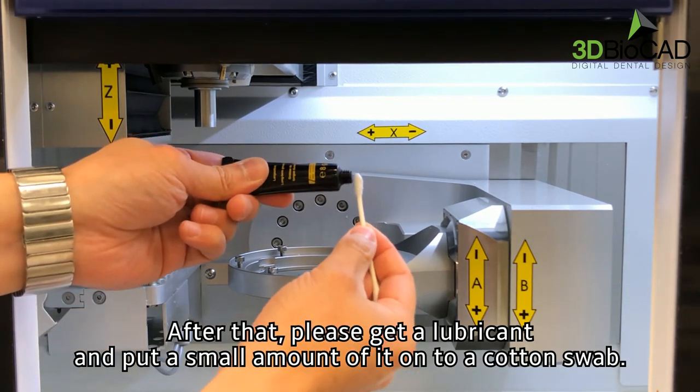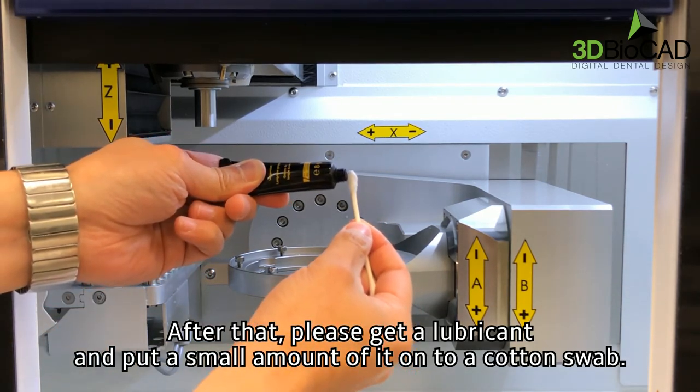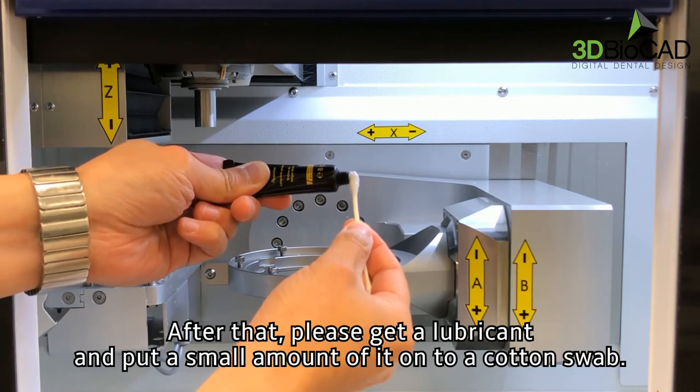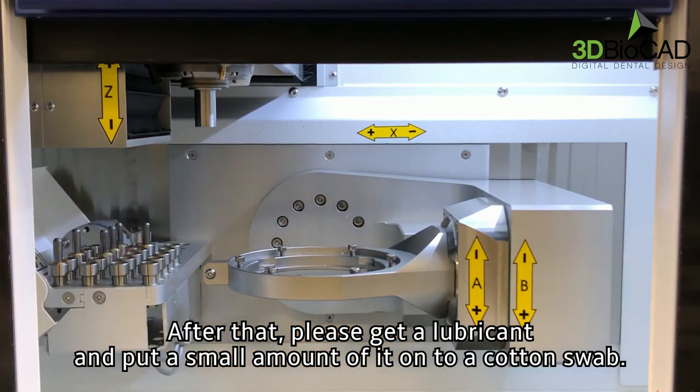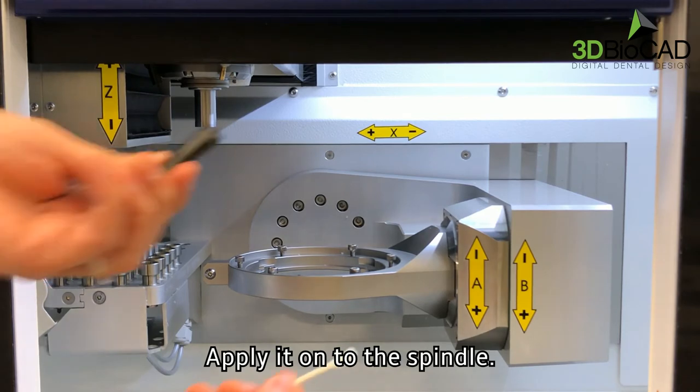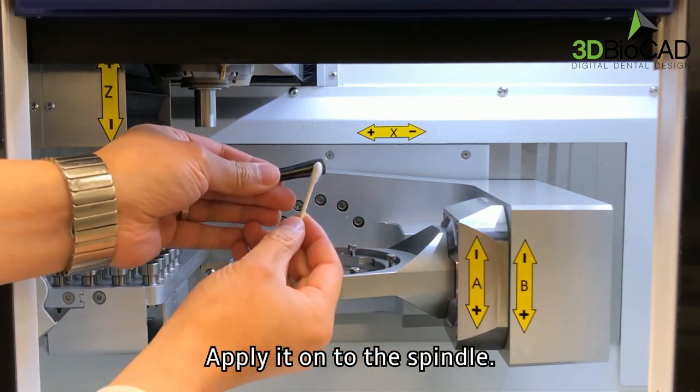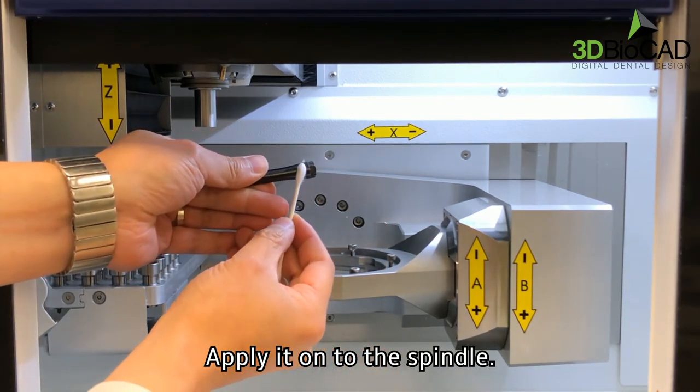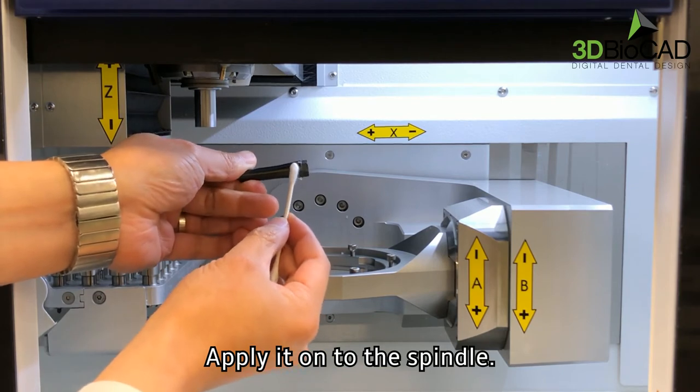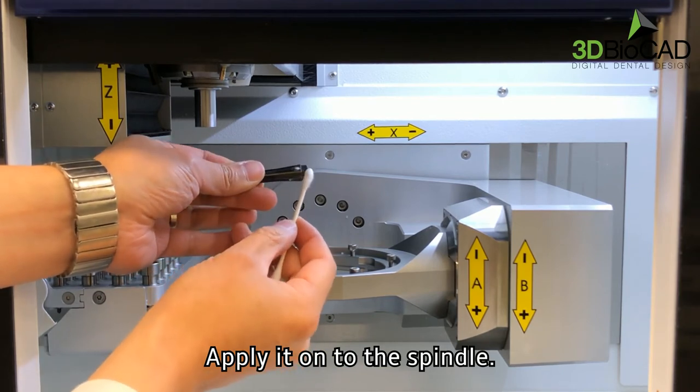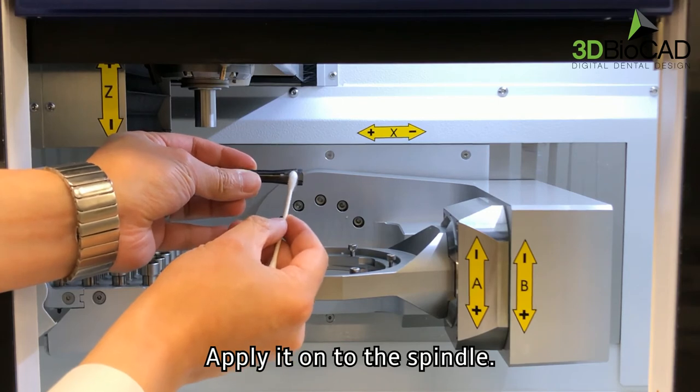After that, please get a lubricant and put a small amount of it onto a cotton swab. Apply it onto the spindle.